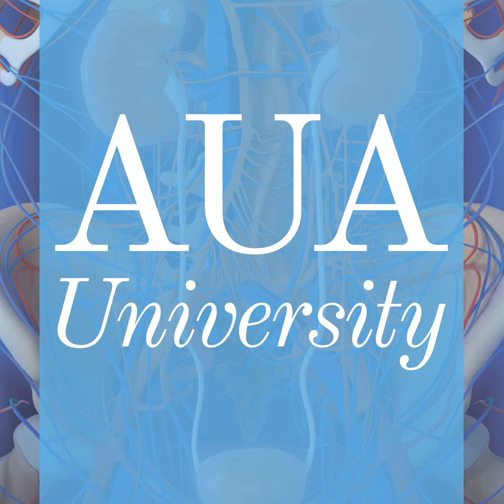F18-1007 tracer. And then we had a classification for our interpretation, similar to the PI-RADS system you use in a multiparametric MRI. So if we have PSMA RADS 1 or 2, we know it's a benign lesion. The 3 is always an equivocal lesion, and 4 and 5 is typically malignant. When we analyze those patients, these are some of these examples where you can see that this F18-1007 tracer will identify many of these very small spots which will not be identified by a gallium PSMA PET CT scan.